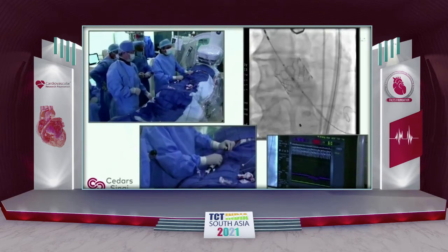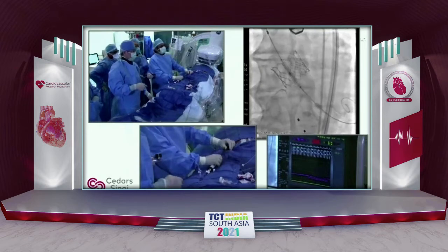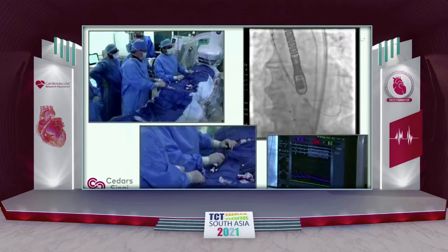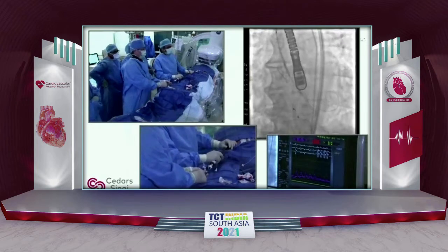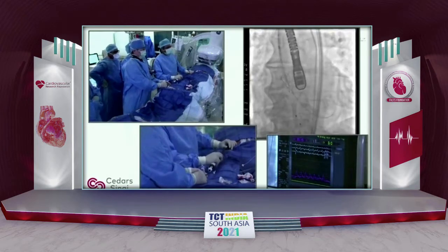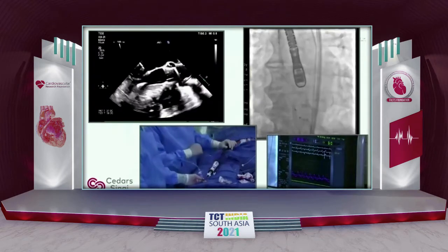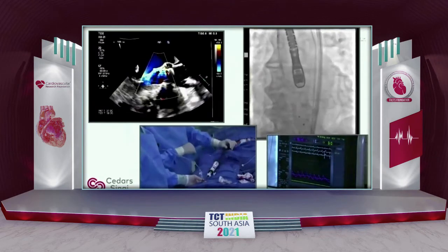Down. Pacer off, please. All right. Can you look at our valve, please? So tell us, did you leave any volume behind, or did you give us nominal? This is nominal. All right.